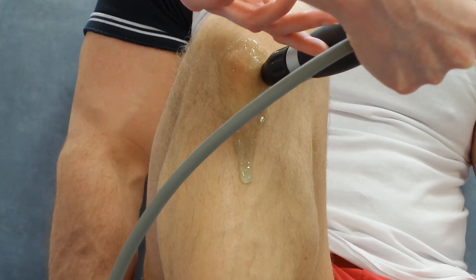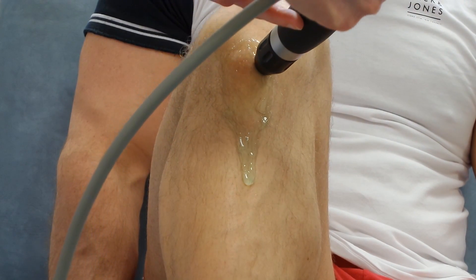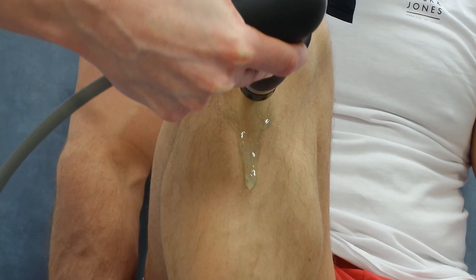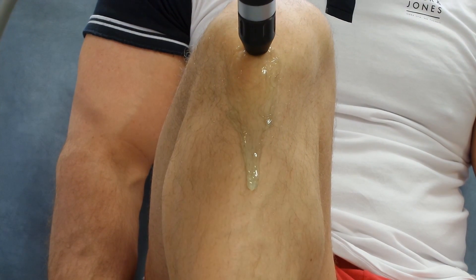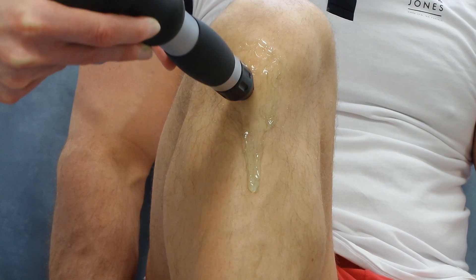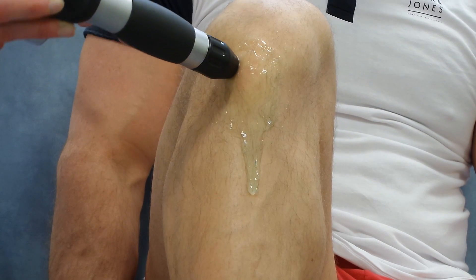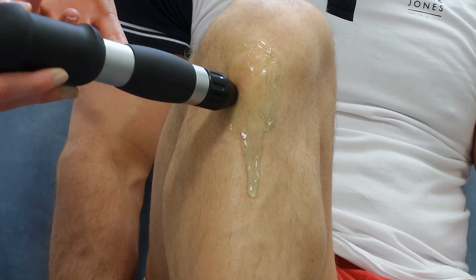As you can see, the therapist is moving the Shockwave around the Osgood Schlatter's. There are areas which are much more painful than others, as you can see by the patient's reaction. The therapist just keeps moving around, as the actual area of bone growth is far too big to treat in spots — hence why this treatment isn't a spot treatment.